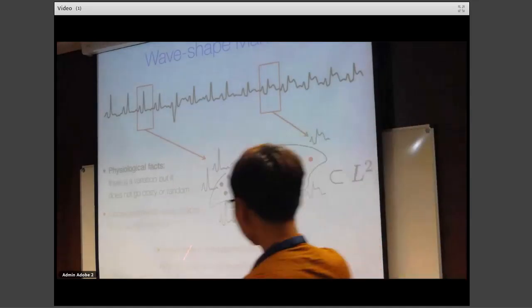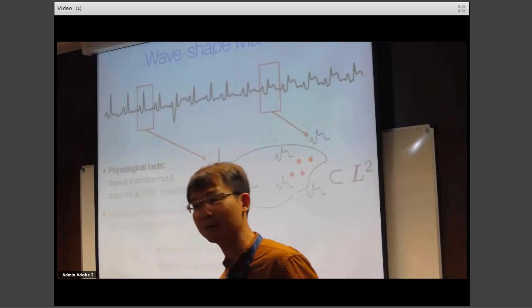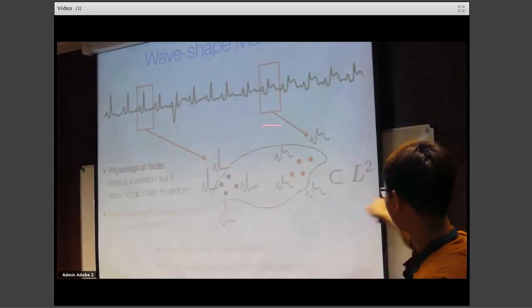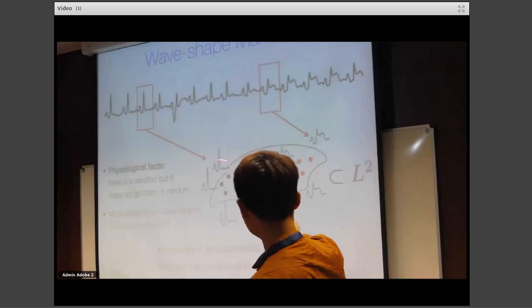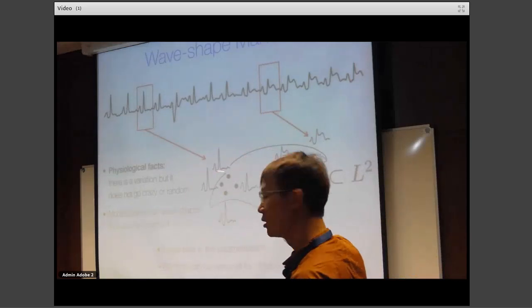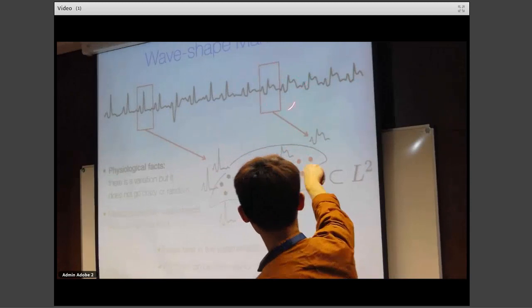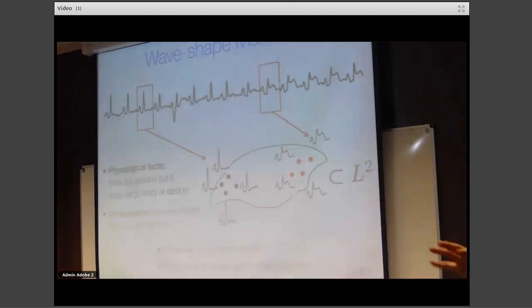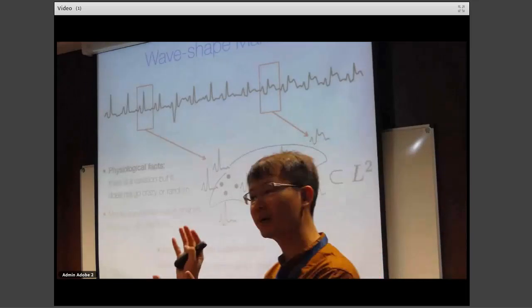Okay, but however, time can give you some very important information which I do not discuss today. But for our purpose, this picture is good enough. So you will see that for those beats without any myocardial infarction attack, they are kind of clustered on the left-hand side. But if you have some kind of MI, it is clustered on the right-hand side. So you can see some kind of clustering to describe the distribution or the morphology or the variability from beat to beat.